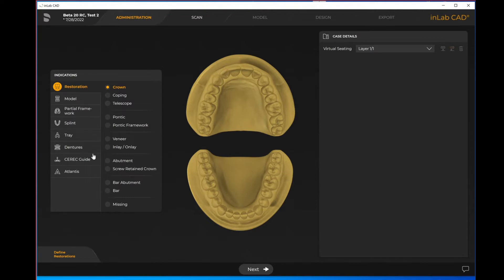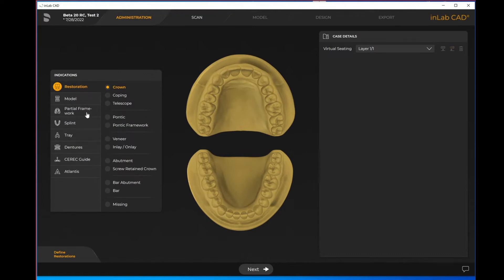You'll also see the tab for model, partial framework, splint, tray, dentures, CEREC guide, and Atlantis. If you do not see all of these it might have to do with what licenses you are currently running. Things like the partial framework, the splint, the tray, and the dentures will only show up if you have the removable module.